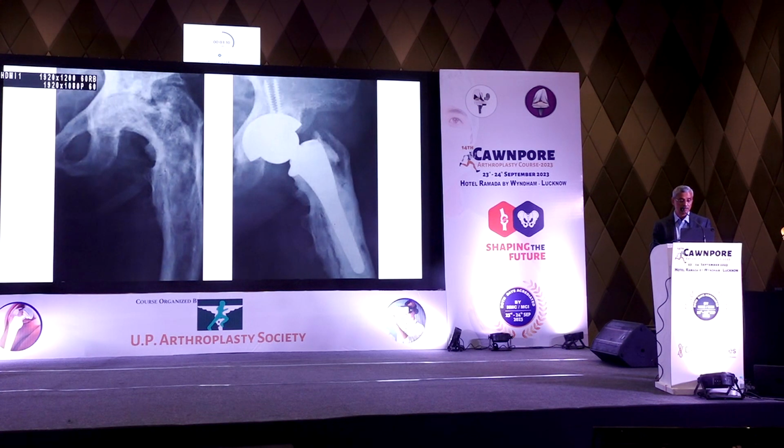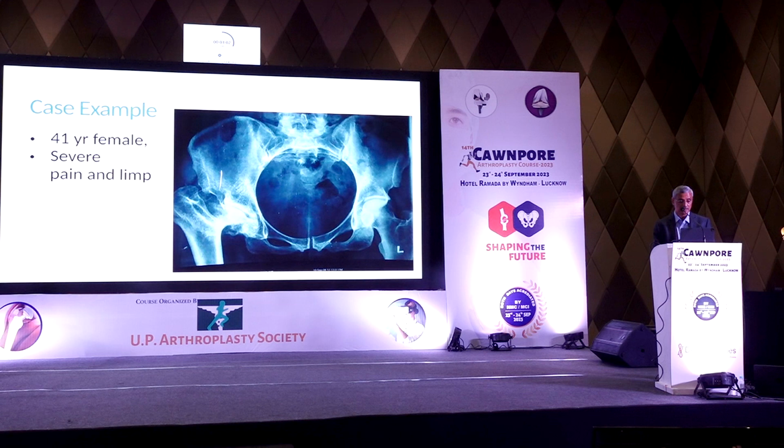And here's one with Paget's disease, Coxa vara, and done like that. These are not my cases, they are from the literature that is available. So in the light of all this, most of the times I struggled with these things, but here's one particular case that surprisingly was amenable to a regular sort of procedure. So that's why I'm showing this. Although I say that most of the times I struggled, probably the hip biomechanics were not restored very well.